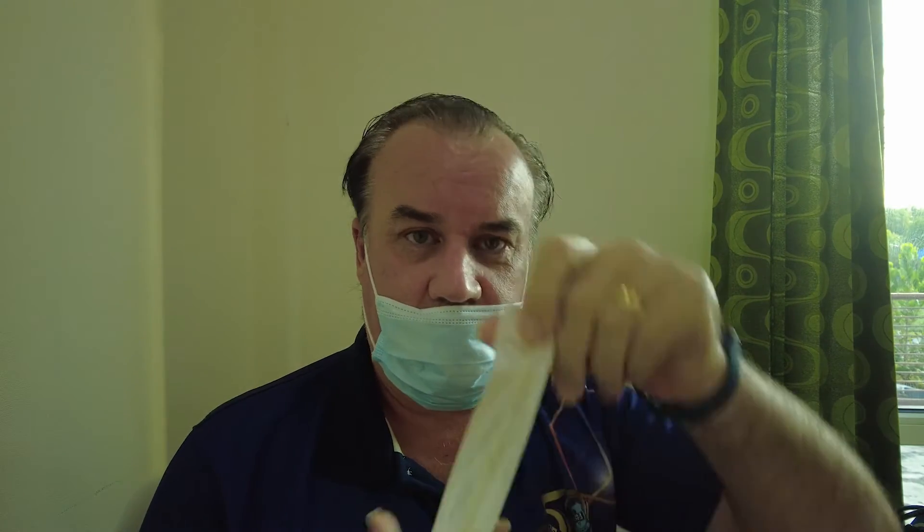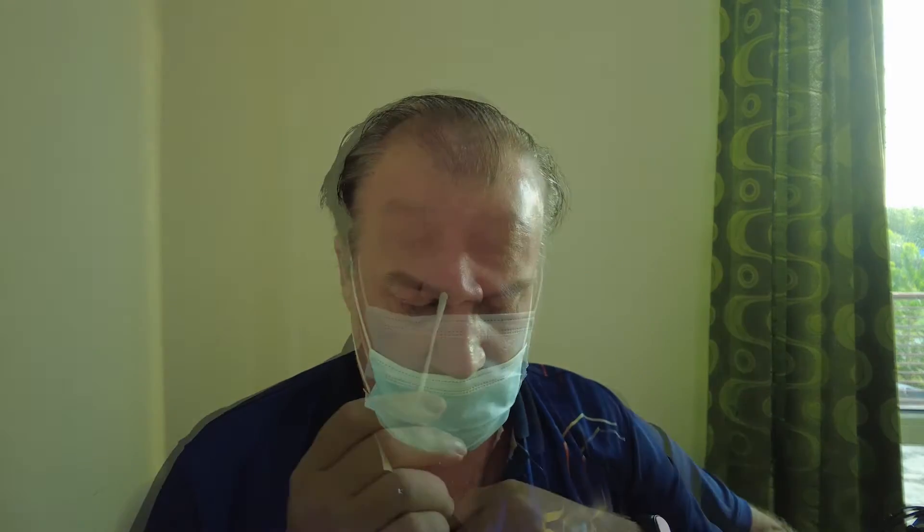Take the swab and insert just the tip into your nostril. Rotate around your nostril 5 to 10 times. Now repeat in your other nostril.